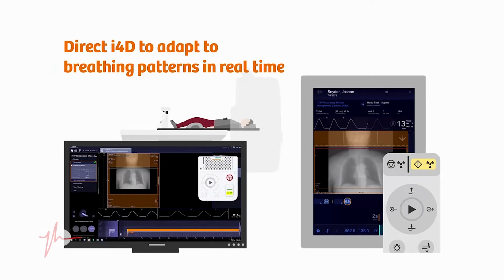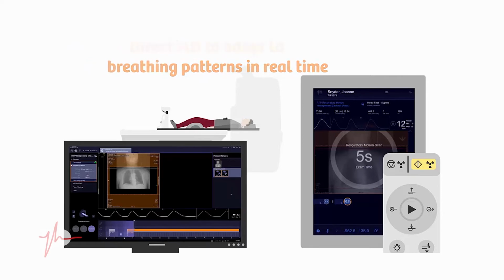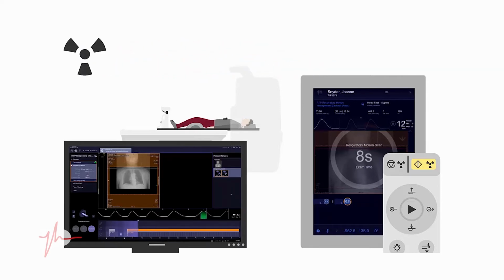Might need you to explain that a little bit. I know what 3D is. What is 4D? So 4D is, like I said, motion management. What it does is it watches the patient's breathing for tumors around the lungs and the diaphragm, and it will track the patient's breathing, therefore helping the doctor and our dosimetrist, when they're making their plan, avoid issues with the patient taking breaths in, and they can track that tumor and give the correct dose to that tumor in that certain breathing cycle.